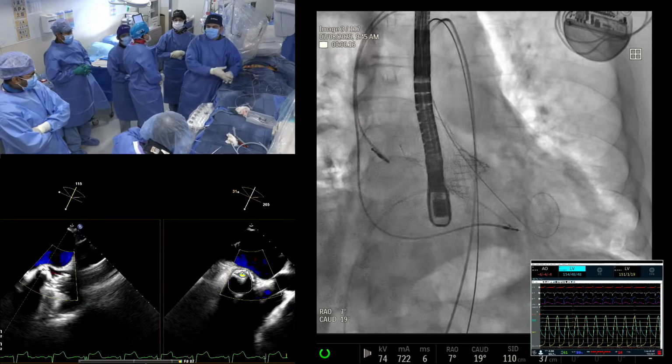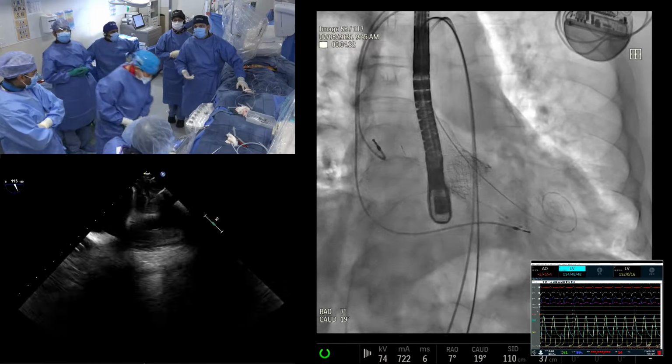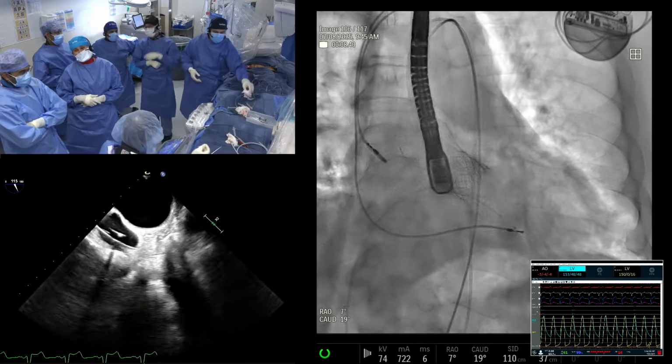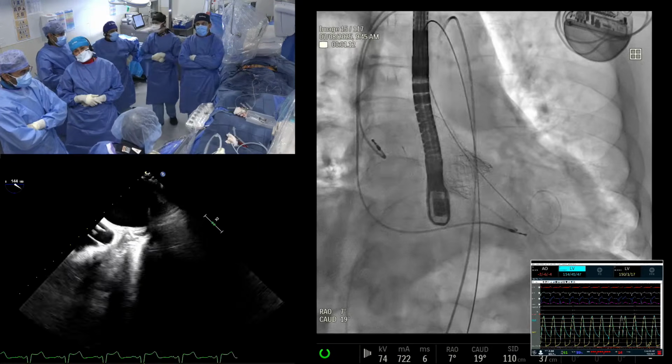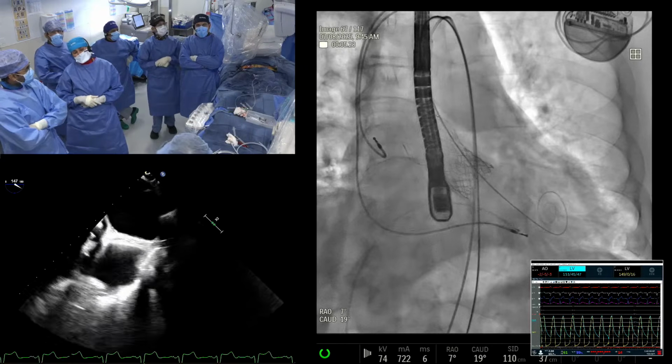It's very important that we used a method to quantify early on, and I think we should use the same method post. But also we should look at AR index as well, right? People still do that, especially in a paravalvular leak situation. How does it show hemodynamically?